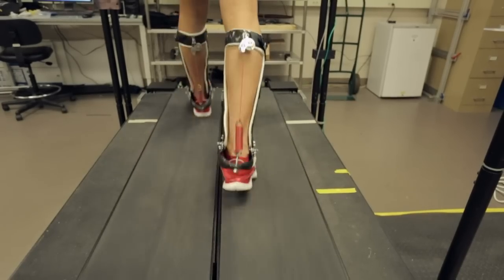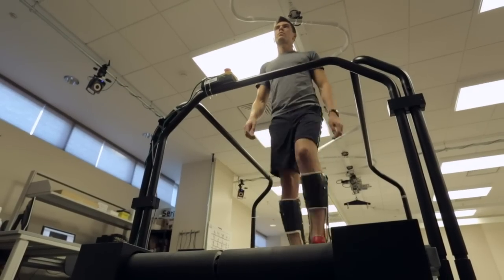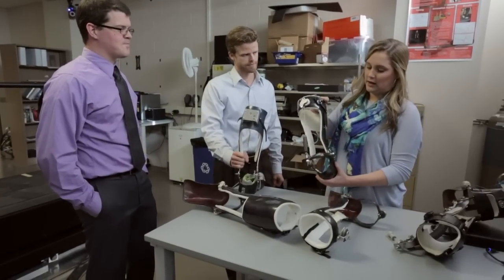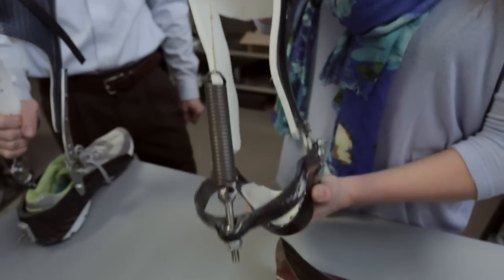We could reduce the forces in the person's calf muscles and actually reduce their energy cost by about 7%. A device like this might be very useful for the normal aging population who are suffering muscle weakness due to atrophy.